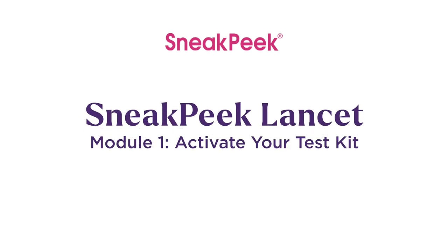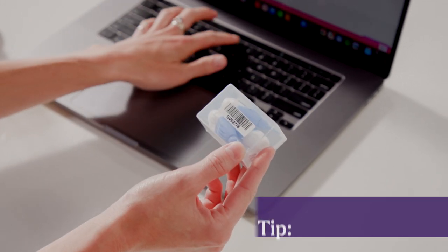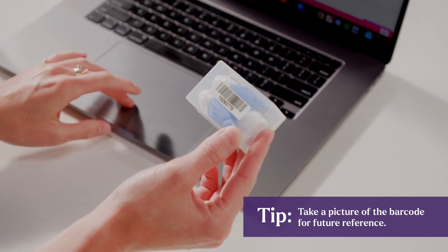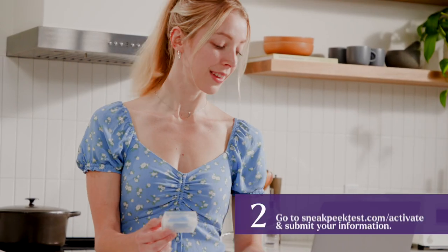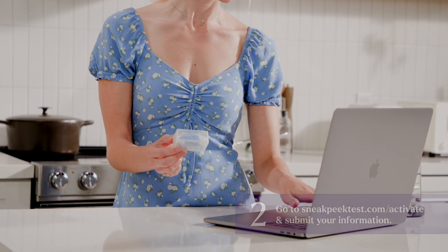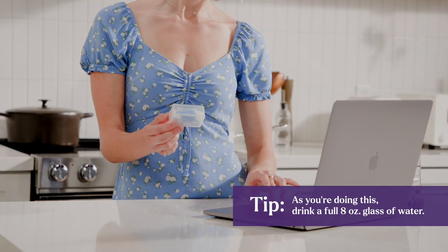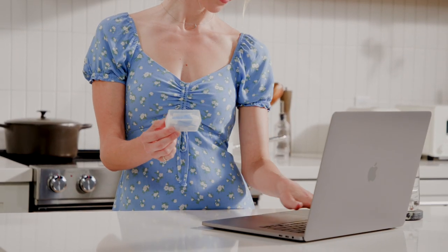First, activate your test kit. We can't process Sneak Peek samples that aren't activated. Locate the barcode under the clear box containing your Lancets. Then go to sneakpeektest.com/activate and submit your information. As you're doing this, drink a full 8-ounce glass of water. This will help with blood flow and make your sample collection easier.